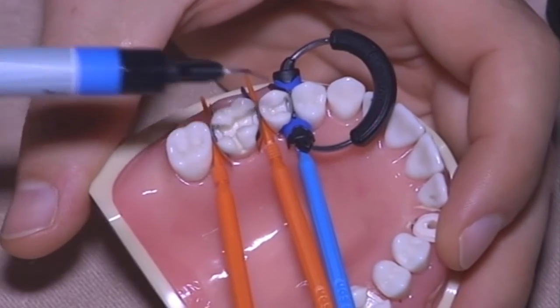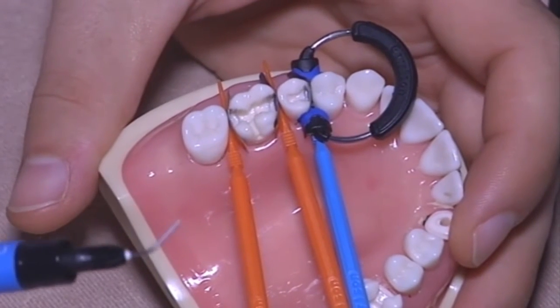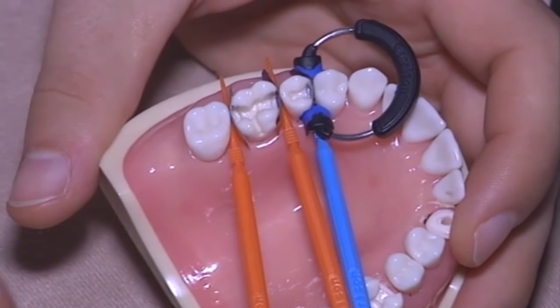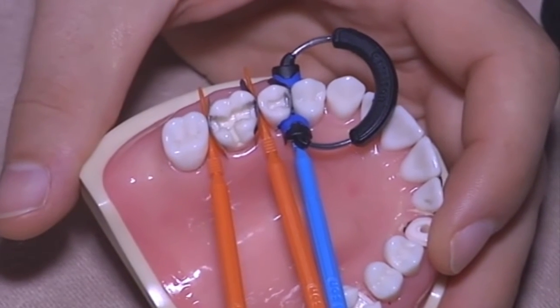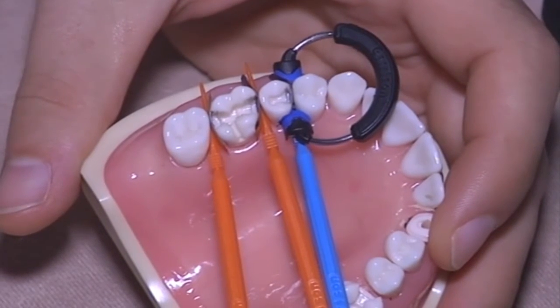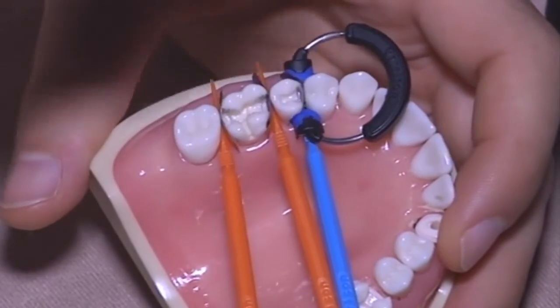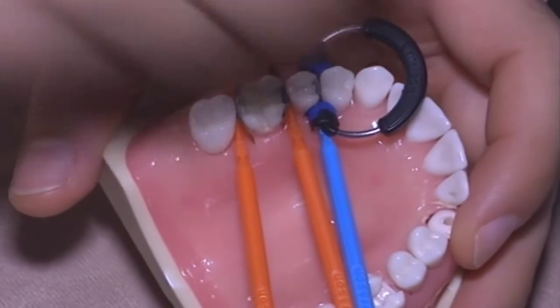Secondly, you reduce the contraction stress of the composite towards the dentin that will come later while curing the composite. And third, the cavity walls become more sticky than the spatula, and so the composite stays where you want to place it inside the cavity and does not come back with your spatula.